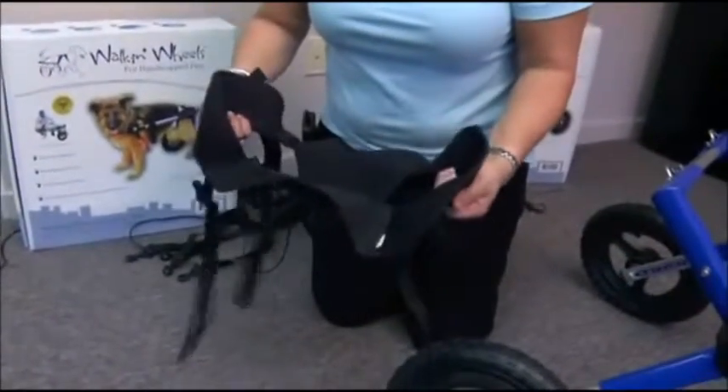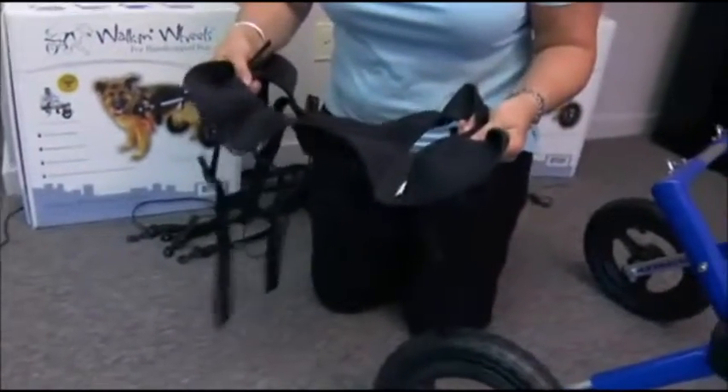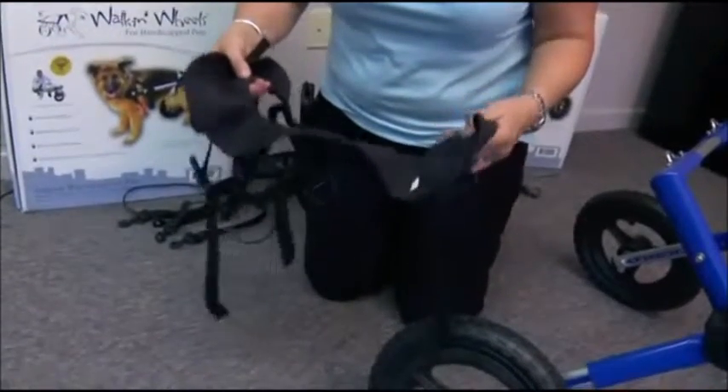This is compatible with the wheelchair, so what we're going to do is put it on Jake and then show you how it clips in and use it as a lifting device also.